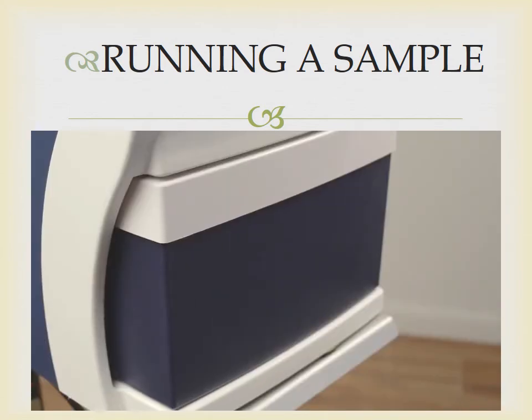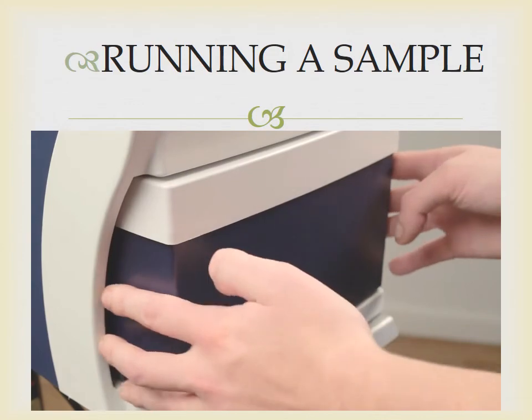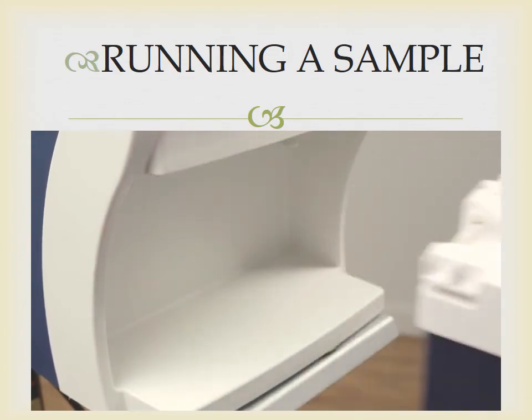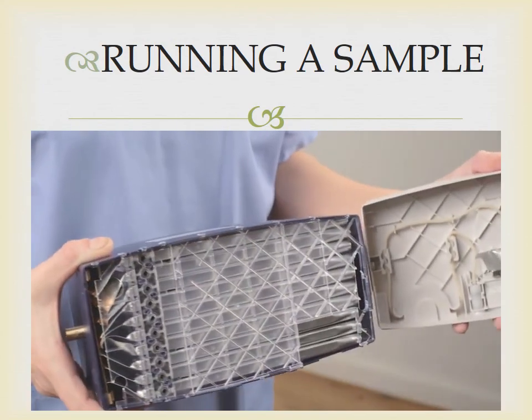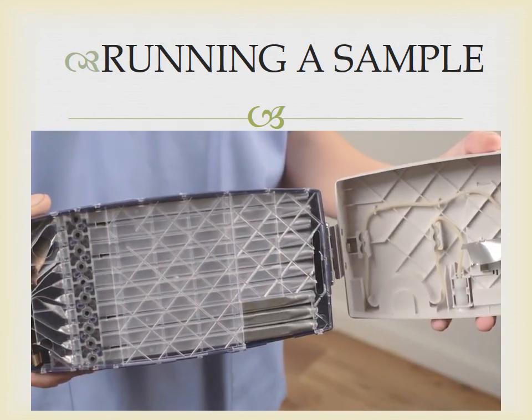The solution pack contains all solutions needed by the analyzer and is also collecting all waste for later disposal. The solution pack contains 3 calibration solutions and 3 quality control solutions.